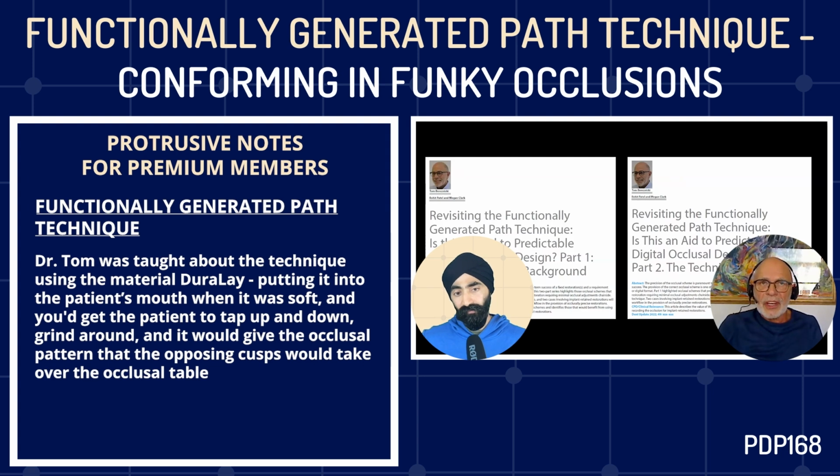And it really meant that the technician didn't have to worry about the occlusal morphology because it was already done there. The only thing they needed to do is maybe put a few more fissures in to make it look like a tooth. But it wasn't additive. The technician wasn't allowed to add. They just could reshape the crown to make it look more like a tooth. So that's where it came from.